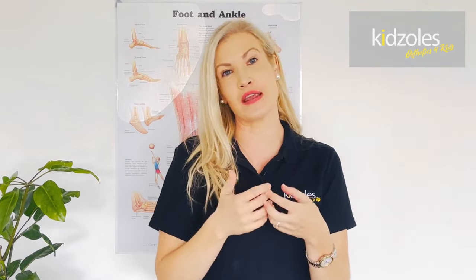Fitting Kidzolz is just so super easy. I'm going to show you really quickly a simple technique we use in the podiatry clinic to fit an insole seamlessly into any type of shoe.